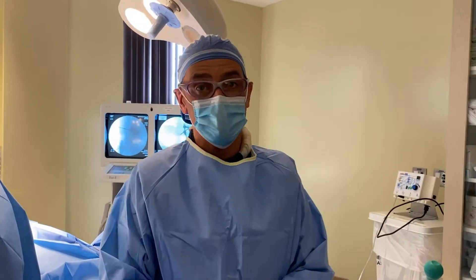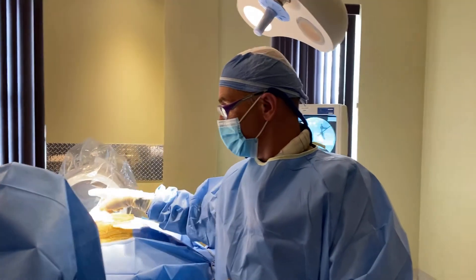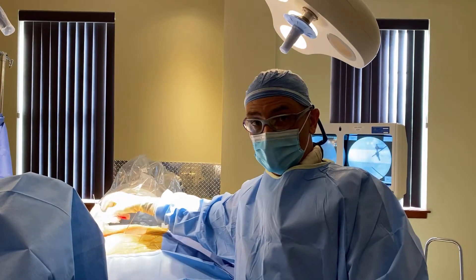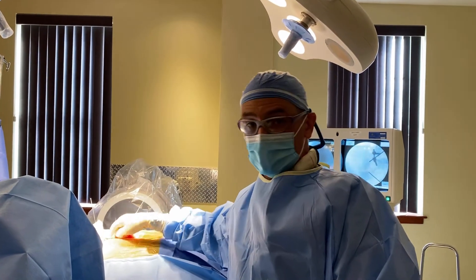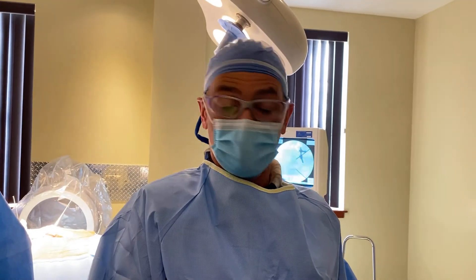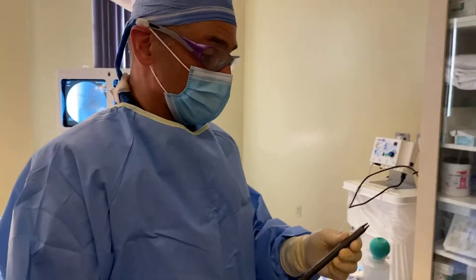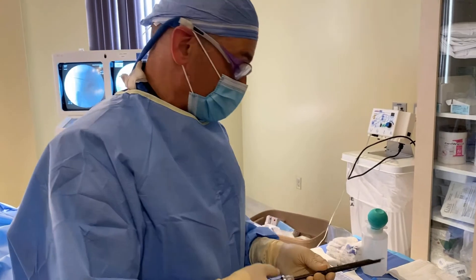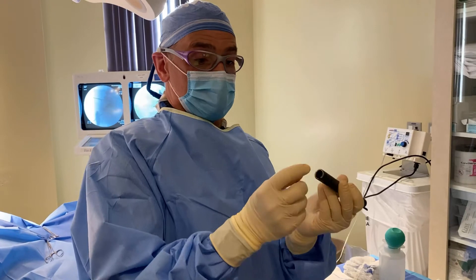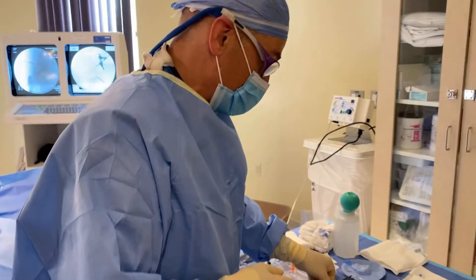We've placed two Steinman pins into the superior and inferior portions of the SI joint. I've made a small two-centimeter incision at each of those two locations. Now we're ready to do the procedure. We'll place a joint finder over each of the Steinman pins to get into the joint and separate it a little bit, then place a working cannula. All the procedure is essentially done through this cannula percutaneously.